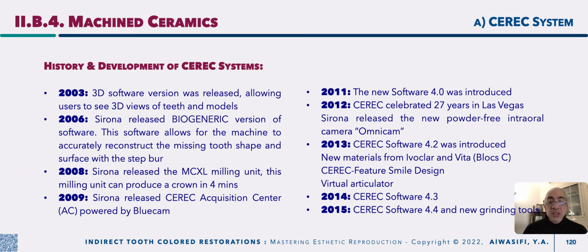What is OmniCam? It's a type of camera that does not require any anti-reflection powder, okay, and could correct any white spot resulting from reflection of light that damaged definite points in your captured photo for the details of your cavity preparation. That's why they reduced the steps required to capture accurately the details of your cavity.